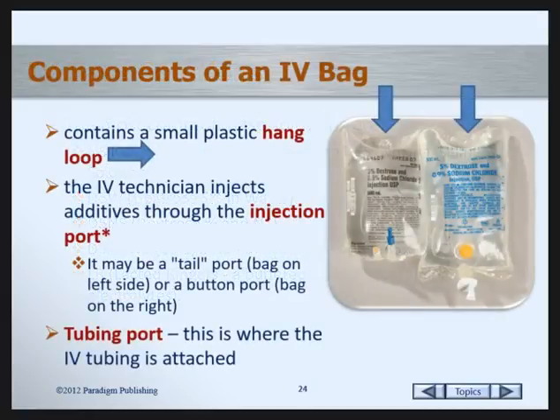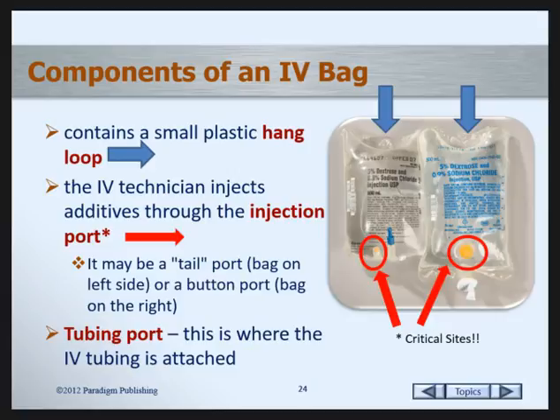Identifying the components of the IV bag. Each IV bag will always contain a small plastic hang loop. That will be at the top of the bag. The IV technician injects additives through the injection ports. Injection ports, once cleaned with IPA swabs, are considered to be critical sites.